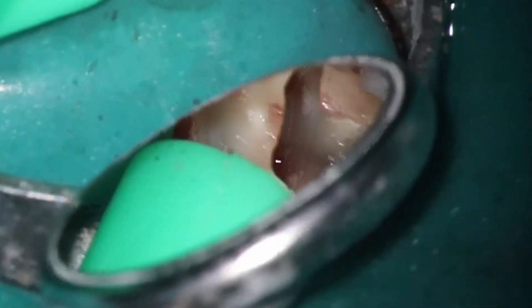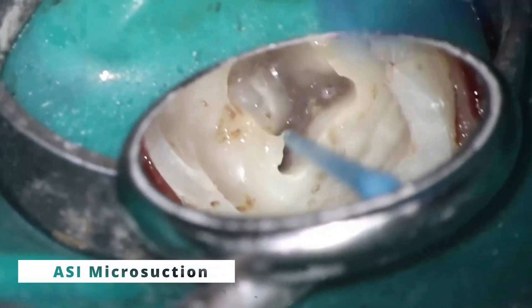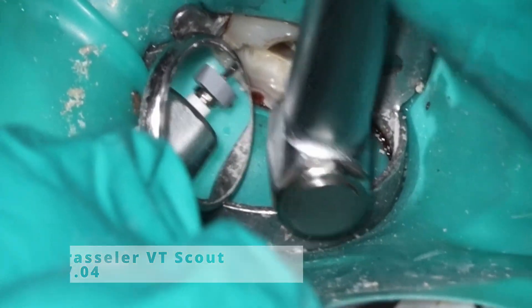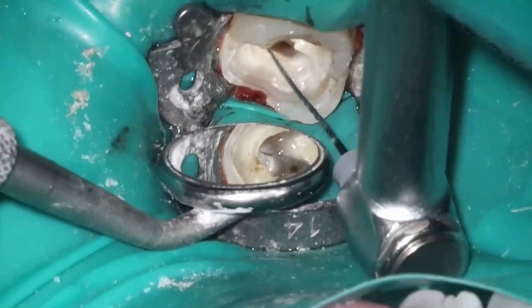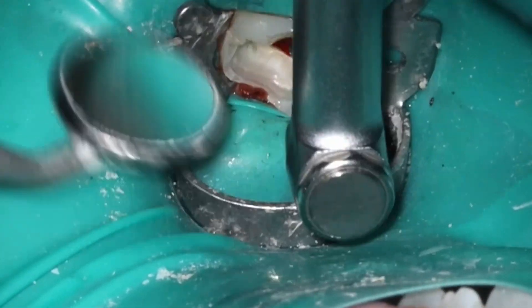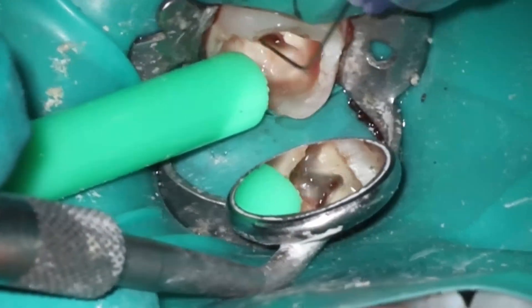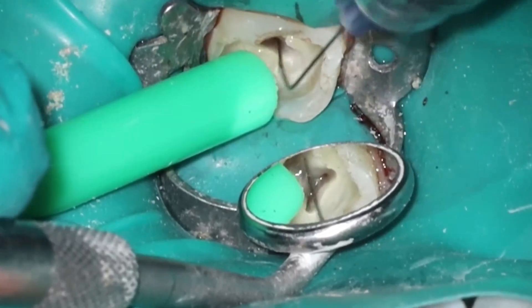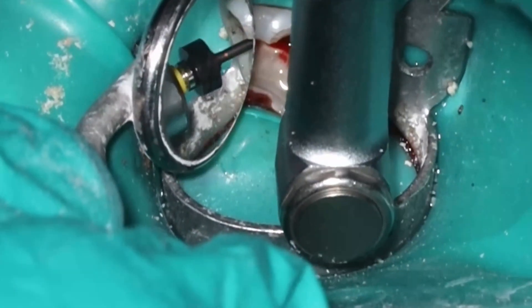This is what I was talking about — just how much bleeding there is. I've gone through, I think at this point, an entire thing of Triton plus two things of bleach. I cut out a bunch of the rinsing, but I definitely used a fair amount of liquid going through here to try to get this cleaned out. As far as working length, it's pretty much the same as any other canal. Do not be surprised if your distal lingual working length is a lot shorter than the other canals. In this case they were all right around 19.5 to 21, but you can have cases where the rest of the canals are at 21 and the Radix is a 17 — that is not uncommon. Once again, this case was not going to work with just removing the decay and putting some MTA putty on top of it. So lots and lots of rinsing — I always rinse with either Triton or bleach because we need to remove as much of that organic tissue as possible.